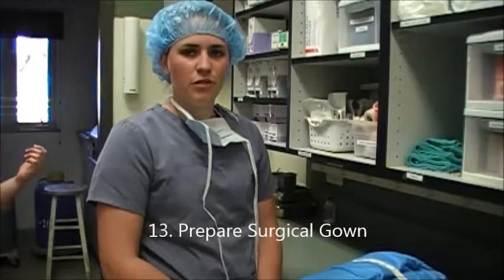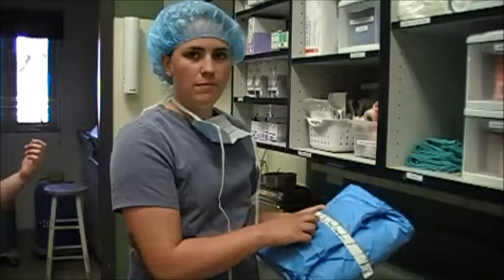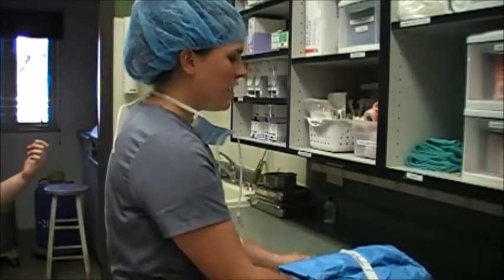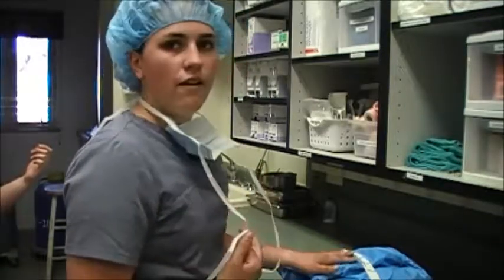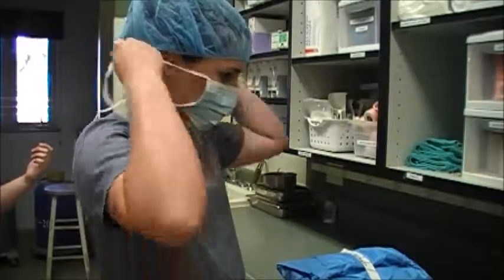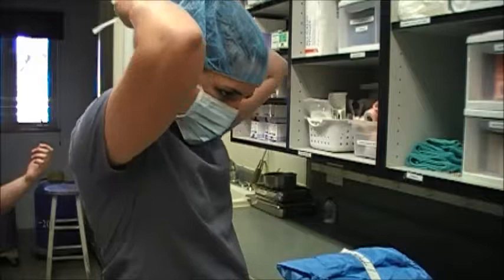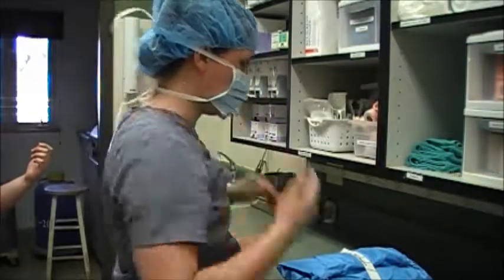I'm getting my gown prepared for my doctor before her sterile surgery. I've selected a large sterile gown. It's got indicator tape that has turned dark from the autoclave, indicating that it has been correctly sterilized. This gown is double wrapped so I can open the initial first wrap without any contamination, and then I'll be more careful for my second sterile wrap. I've got my cap and mask on to make sure I'm not contaminating, and I'm prepared for surgery and sterile.